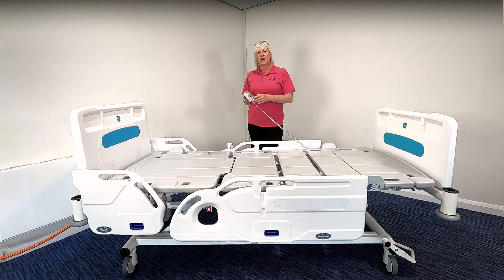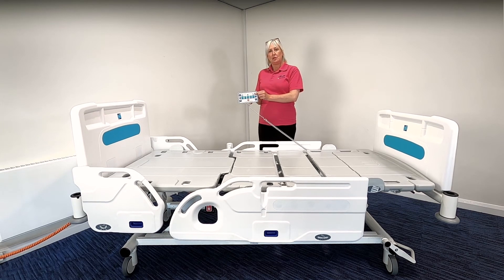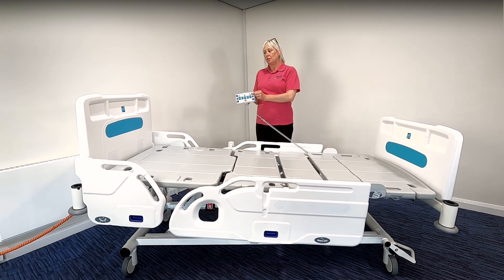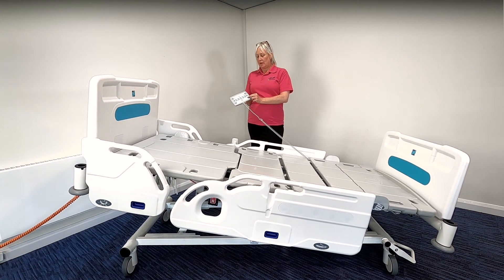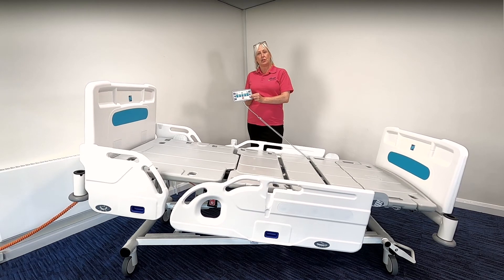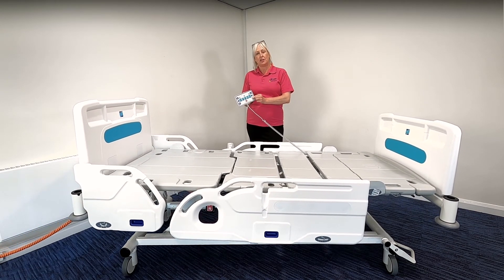The final function on the bed is the Trendelenburg, which is a head-down tilt function, and the reverse Trendelenburg, which is a foot-down tilt function. By pressing the function button, simply press up to achieve a foot-down tilt of 13 degrees, and then pressing the down button you can achieve a head-down tilt of 13 degrees.